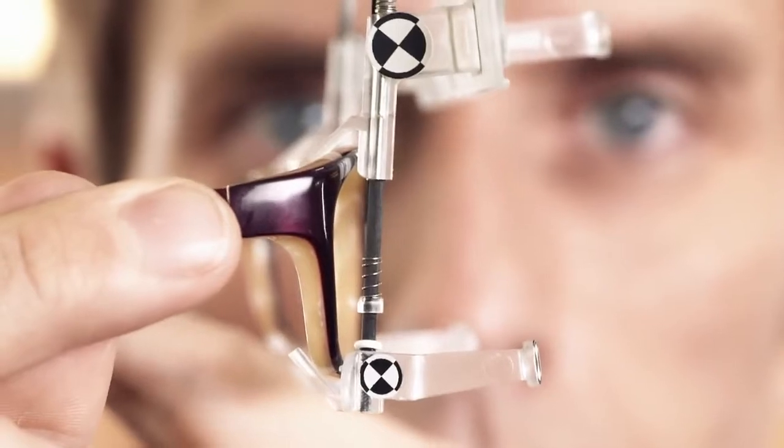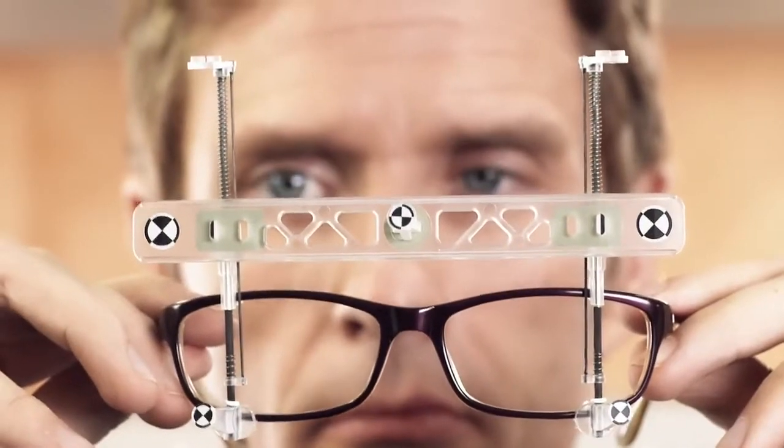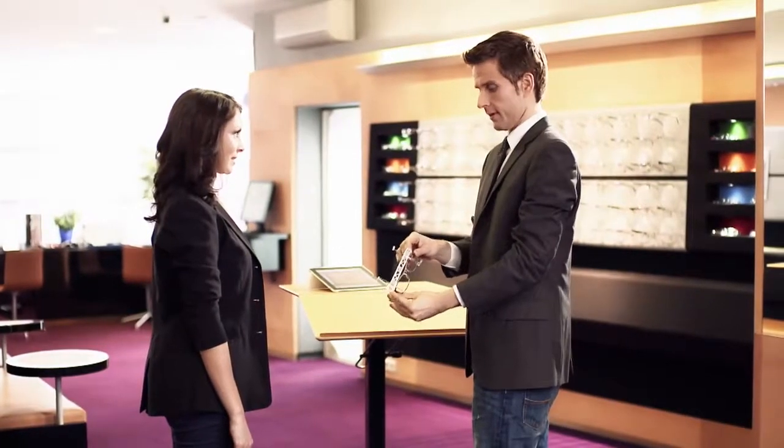Check if both spring struts are aligned parallel to the face form plane. Check if the bottom retaining bars stick out vertically from the rim of the frame.